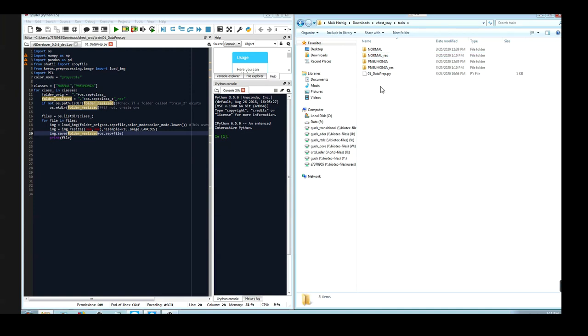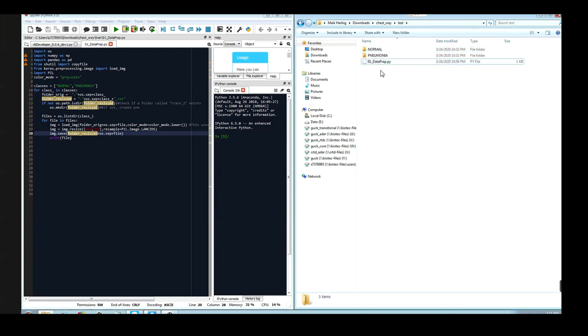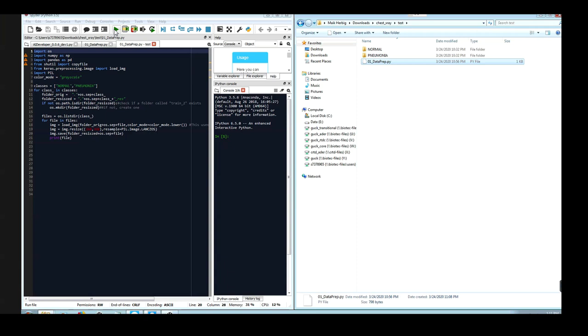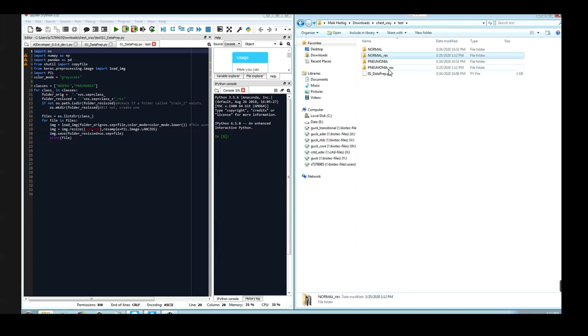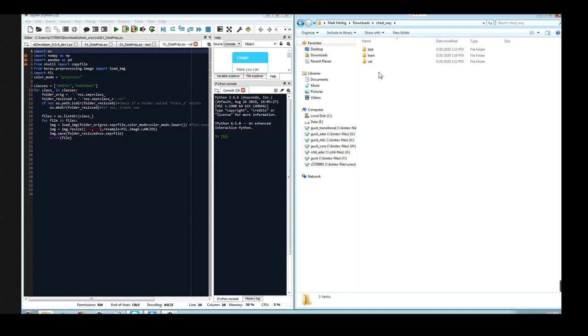Now we have to go through the same steps for the testing and the validation set. I already copied and pasted the identical script, which I will now also execute. Again, when the script finished, you will find these folders with underscore res, and we perform the same operation for the validation set. Okay, now we finished preparing the data.